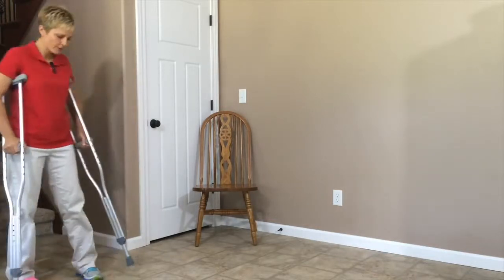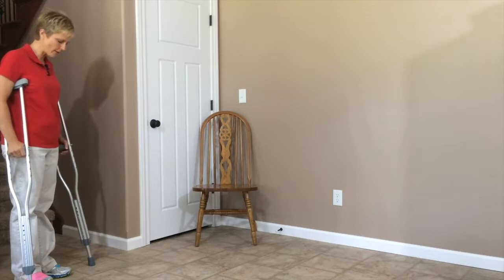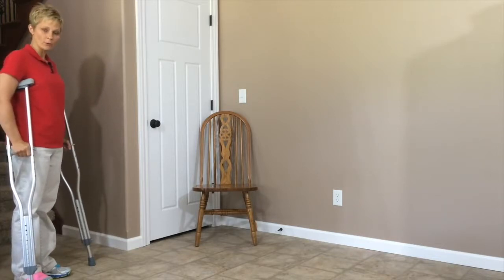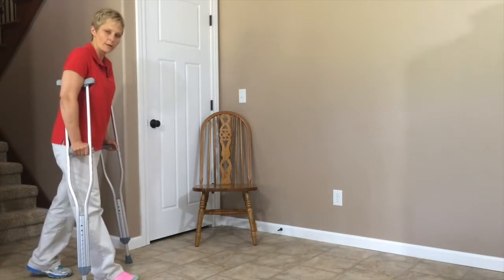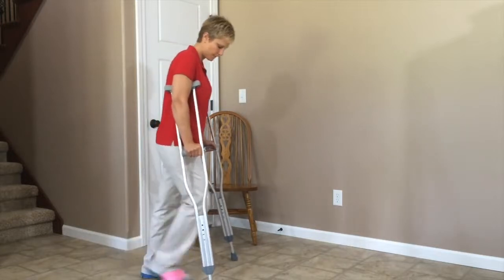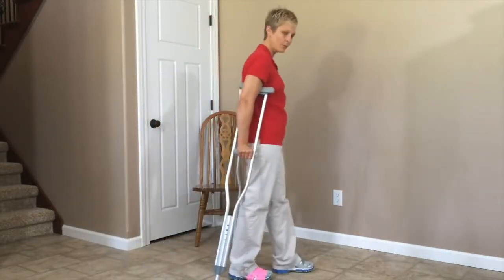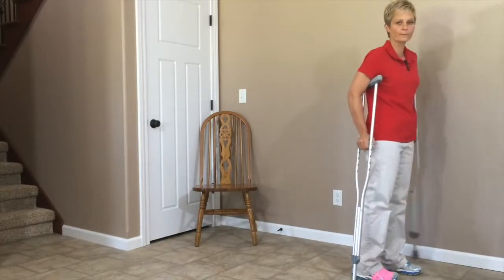You can also walk with crutches if you are partial weight bearing, or if you're allowed to put some weight on that injured leg. The way you do that is: put the crutches forward, step up with your injured leg, and step through with your good one. Crutches, injured leg, through with the good one — repeat that pattern.